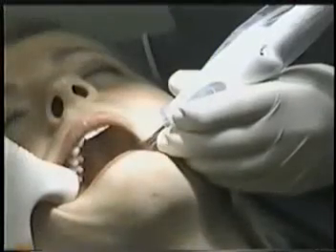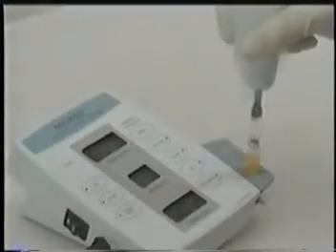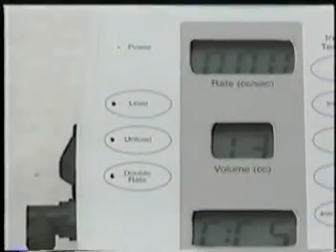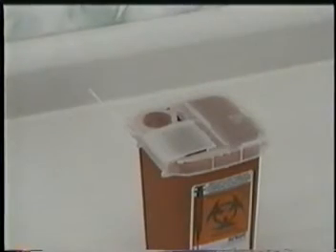Press stop when you've completed the injection and remove the needle from the patient. Recap the needle using the recapping station, remove the plastic sleeve, press unload, and wait for the indicator light to turn off. Remove the cartridge sheath with the needle attached, turning counterclockwise. Dispose of in any approved Sharps container.